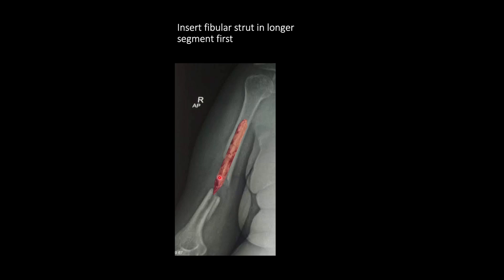Once shaping is done, push the fibular strut into the longer segment first. You have to push the fibular strut in this segment as proximally as possible, until only some part of the graft is proud at the fracture site.